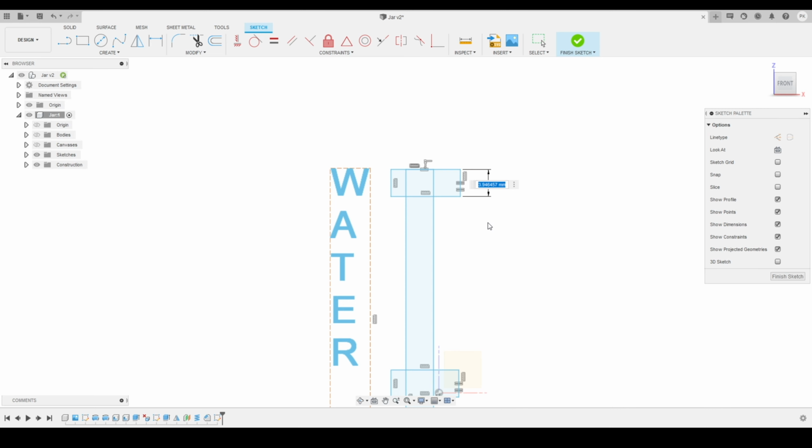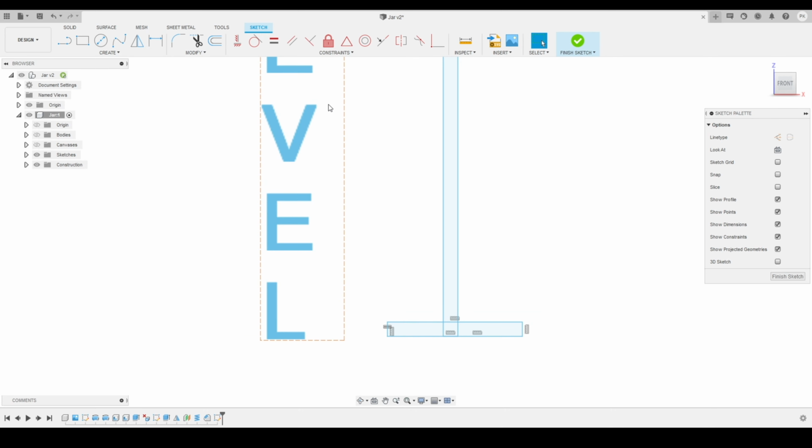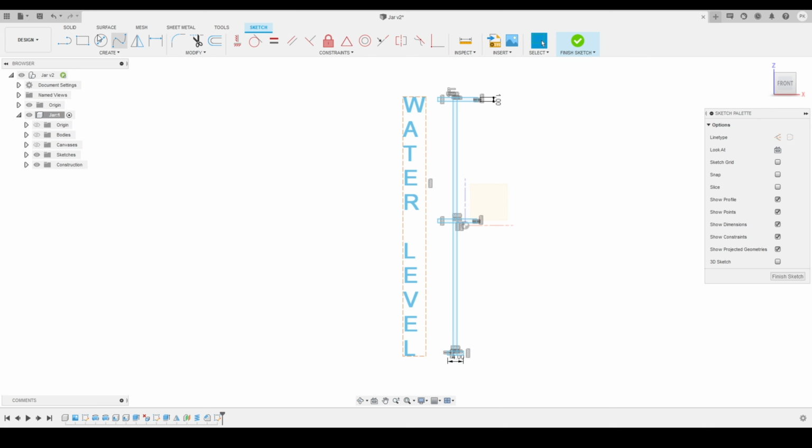So I will just specify this one as 1 millimeter. Here you can see, this is the kind of shape we got. Then we'll adjust the position of these sticks a little bit more by applying a few more dimensions. Like this one, I just want to keep 10 millimeter, 4 millimeter, and we'll adjust it a little bit like this. Here you can see, and we'll make sure that all of them are equal.